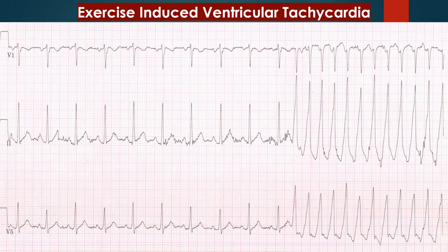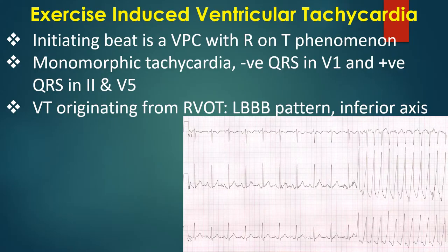Here is an ECG showing ventricular tachycardia occurring during a treadmill exercise test. The initiating beat is a ventricular ectopic beat with R-on-T phenomenon. It is a monomorphic tachycardia with negative QRS in V1 and positive QRS in leads 2 and V5. This could be a tachycardia originating from the right ventricular outflow tract, as it has an LBBB pattern and inferior axis.